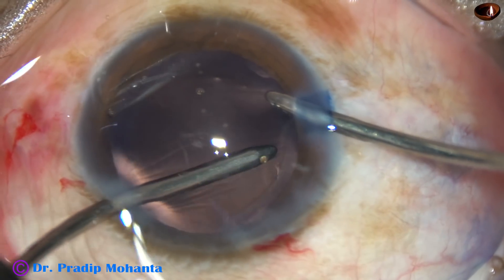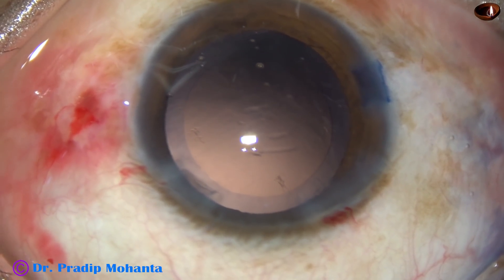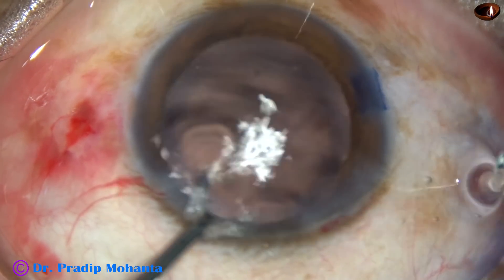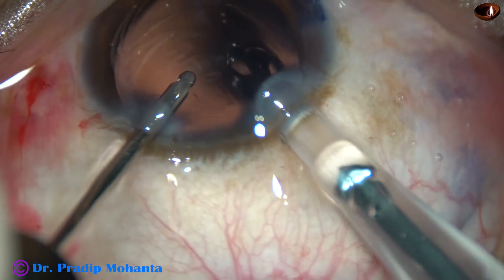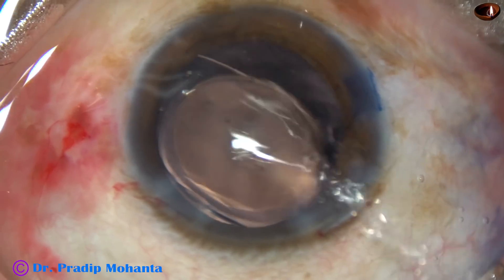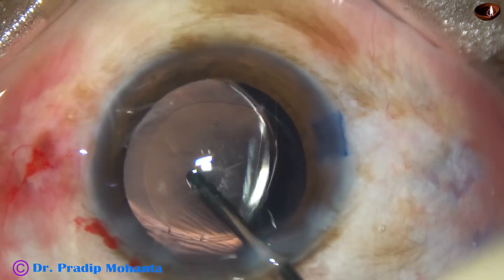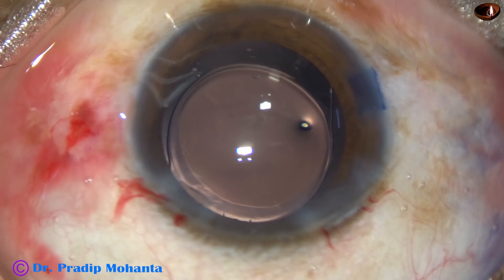Irrigation and aspiration is being used together in FACO in IA2 mode, where the vacuum is very low — only 20 millimeters of mercury. And now, this is hydro implantation: keep the anterior chamber formed with irrigating fluid and inject a hydrophobic acrylic single-piece monofocal intraocular lens into the capsular bag. The lens has gone into the capsular bag. Irrigate the capsular bag because there was some viscoelastic used in the lumen of the cartridge.